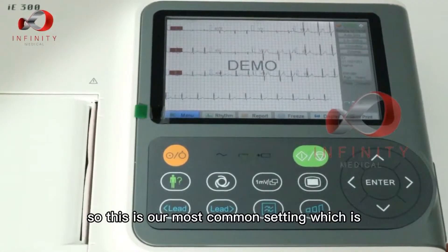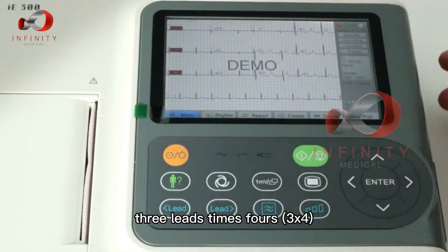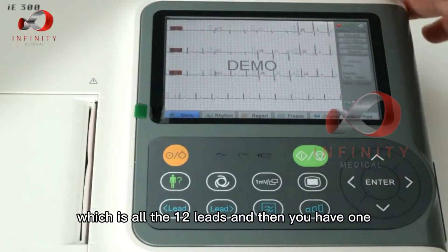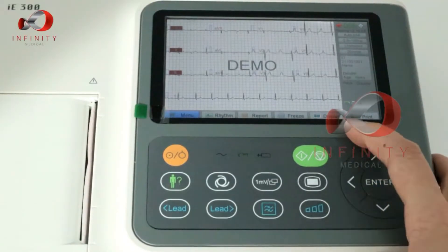This is our most common setting, which is three leads times four — so you can see here is three leads times four, which gives all 12 leads, and then you have one rhythm lead here.